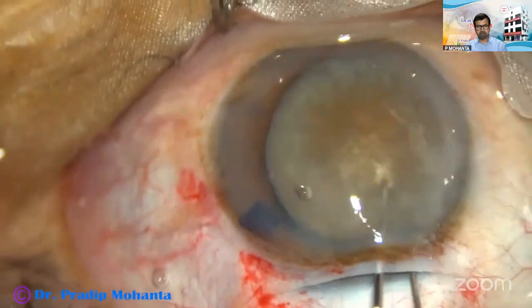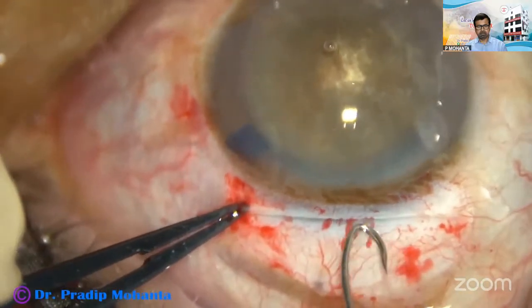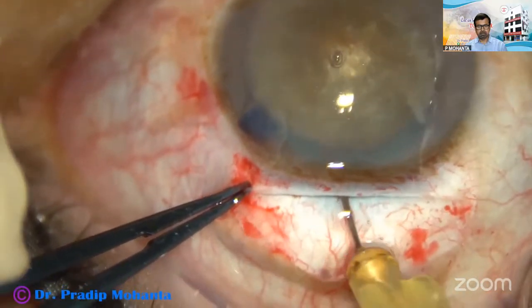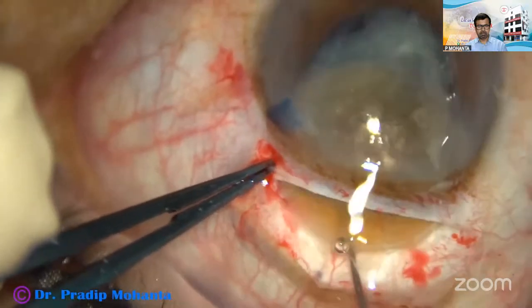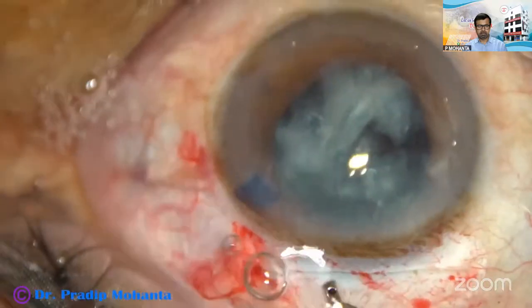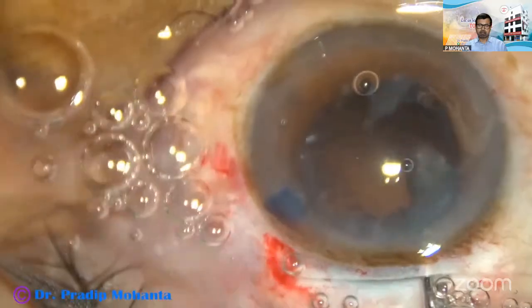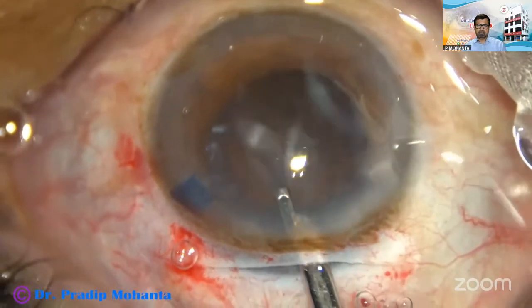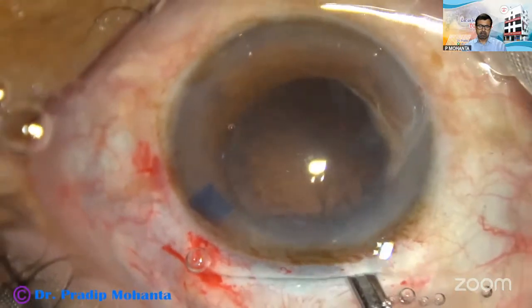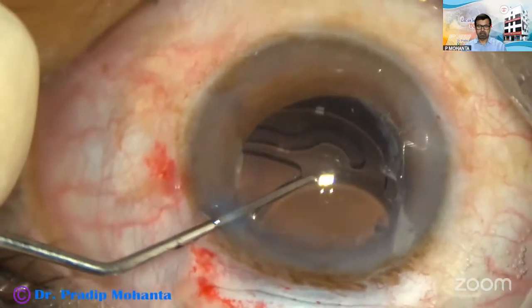The nucleus is prolapsed. Again, I prefer the fish hook to deliver the nucleus. It goes and the nucleus is easily delivered out of the eye. And cortex is cleared and a lens is placed in the bag.